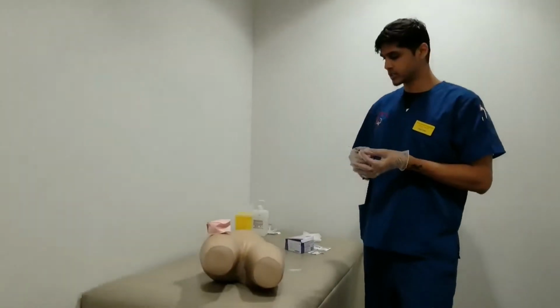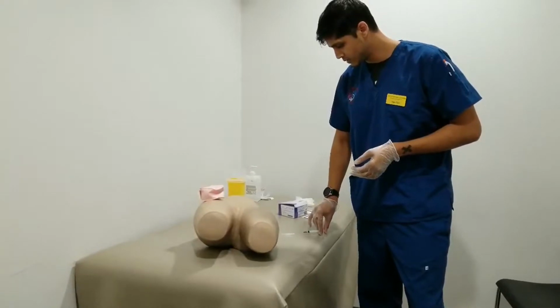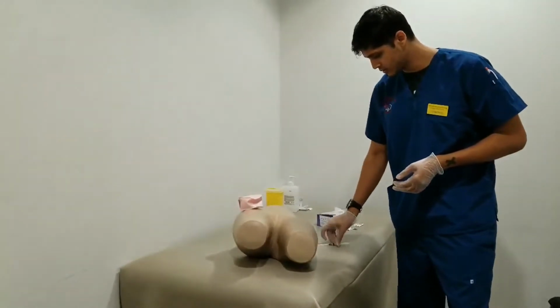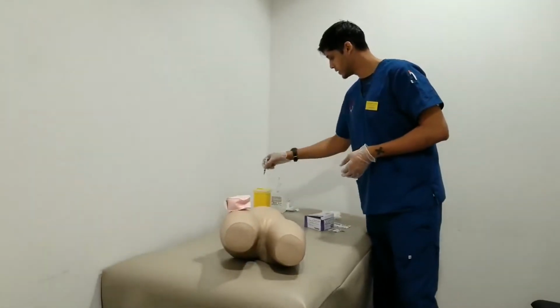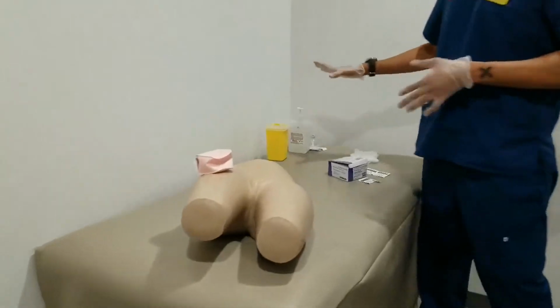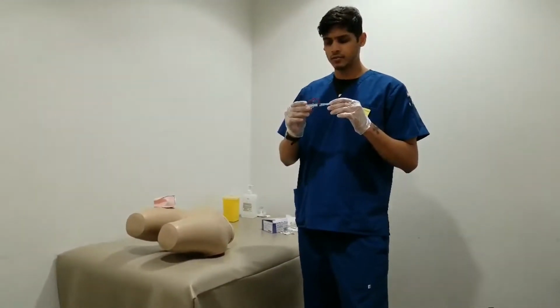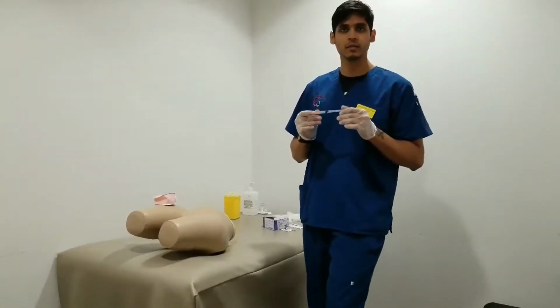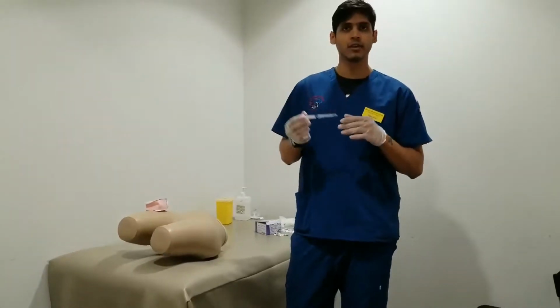Okay, once that's done, I will put the needle back in a sheath using one hand and discard it in the sharps container. Our next step, our next injection we're going to take is our Haldol. It's the IM injection. The difference between IM and subcutaneous, as mentioned earlier, is the depth of the injection.